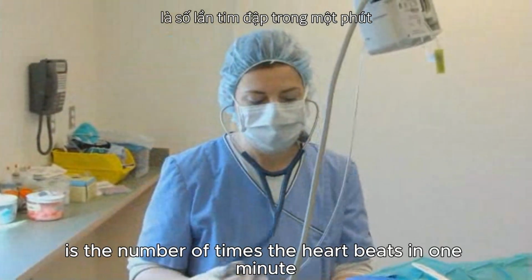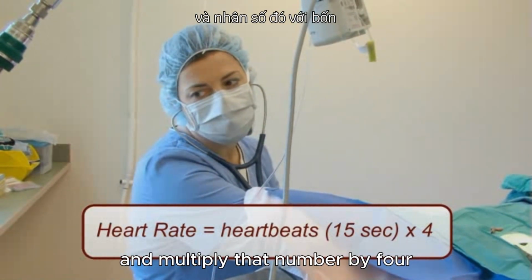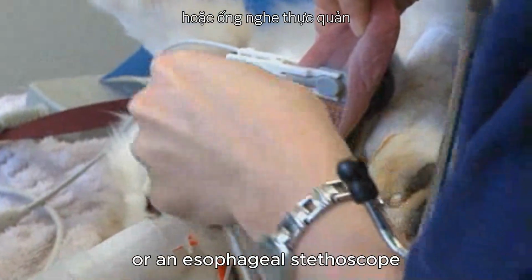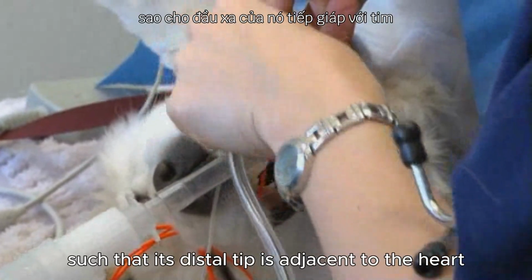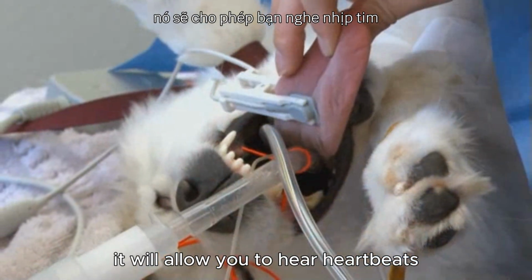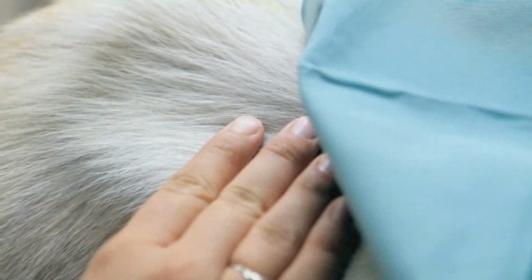Heart rate is the number of times the heart beats in 1 minute. An easy way to calculate this is to count the number of beats in 15 seconds and multiply that number by 4. A stethoscope can be used when the patient's chest is accessible, or an esophageal stethoscope can be used when it is not accessible. The esophageal stethoscope utilizes a tube placed in the esophagus, such that its distal tip is adjacent to the heart. When properly placed, it will allow you to hear heartbeats. The pulse and heart rate can also be evaluated by digitally palpating on the back side of the tongue, or by feeling other major pulsatile blood vessels.